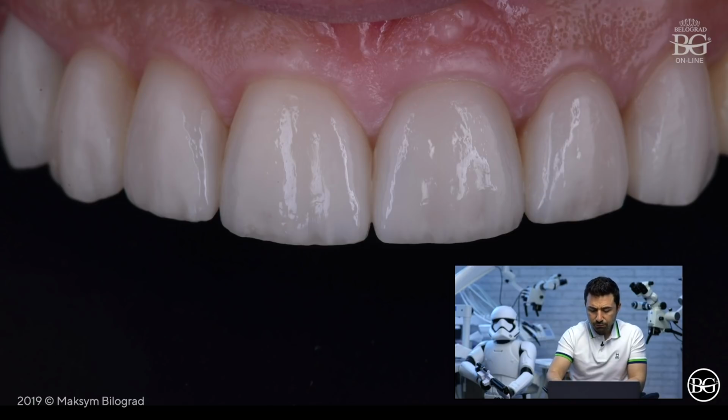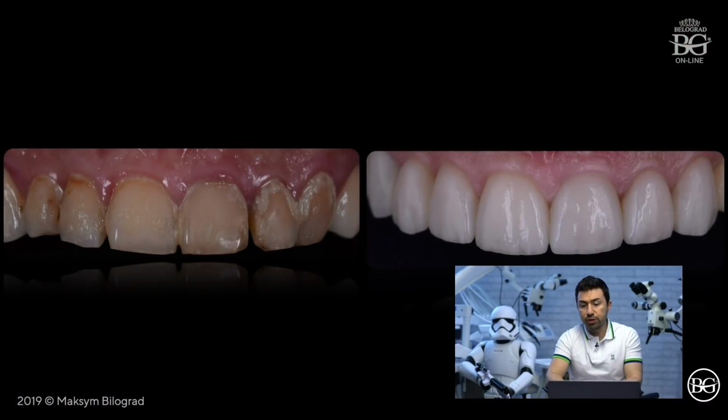In this case, we have a 6 month follow-up, before and after. I will show you some x-rays also. And what I was really proud of is that in this case we were able to transform pretty dark teeth, like A3.5, into BL3 as the patient requested, and dental hygiene was pretty good within these 6 months.